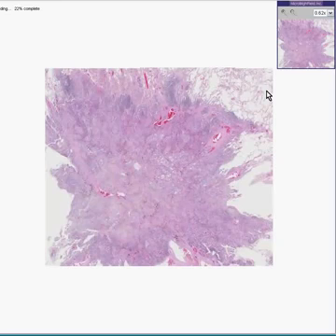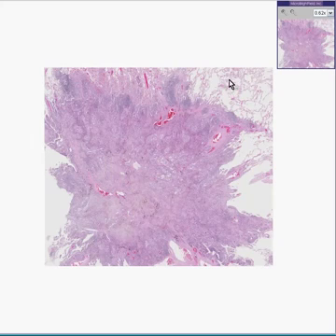You could see normal spongy lung out here, maybe even a little emphysematous if you think some of these alveoli are bigger than they should be. And then you could see an irregular margin. You could imagine even now that there are some lymphoid nodules and lymphocytes at the interface between this tumor and the lung. And up here you might even be able to see a germinal center, and possibly here too. But here's the lung. Let's say we didn't know it was at the periphery or the hilum, and we just wanted to blow it up a couple of notches.